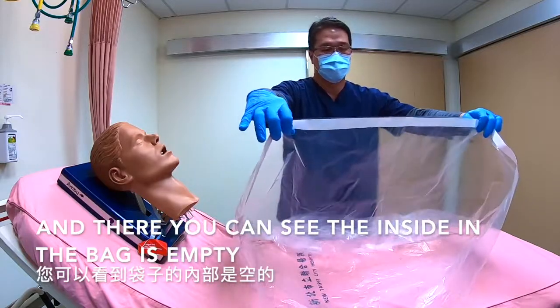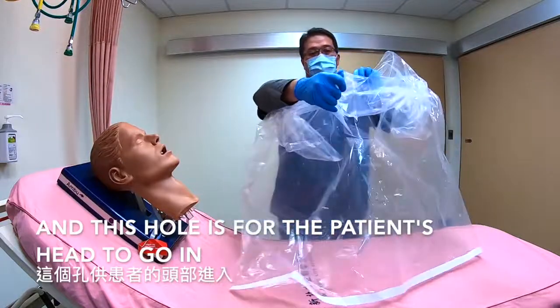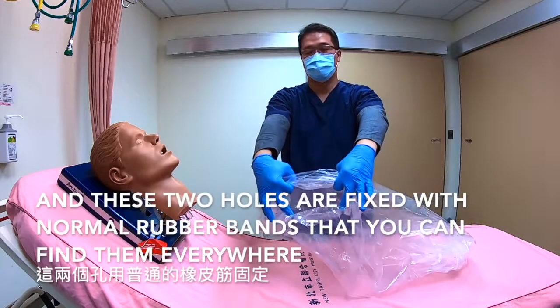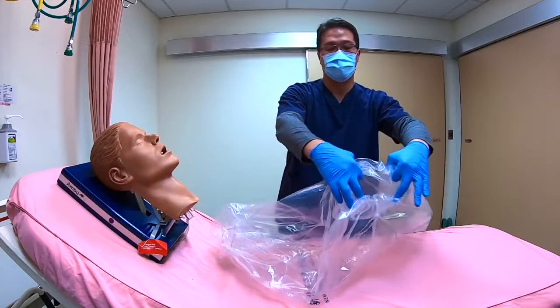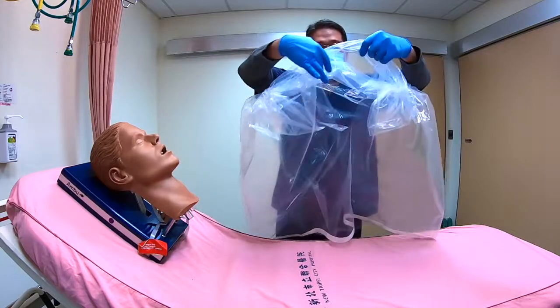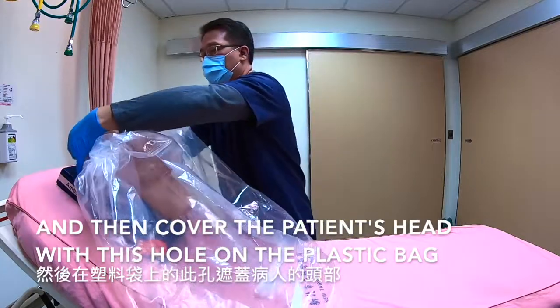The inside of the bag is empty, and this hole is for the patient's head to go in. These two holes are fixed with normal rubber bands that you can find everywhere. Then cover the patient's head with this hole on the plastic bag.